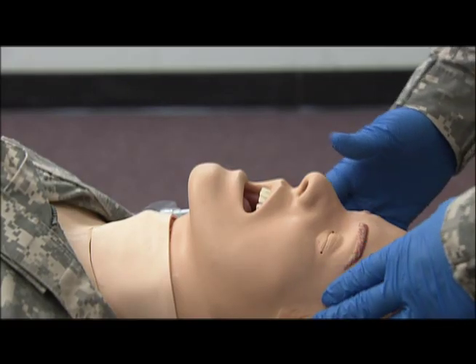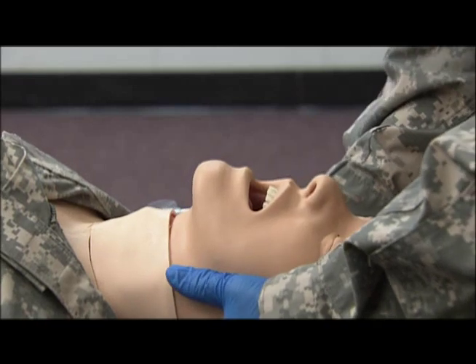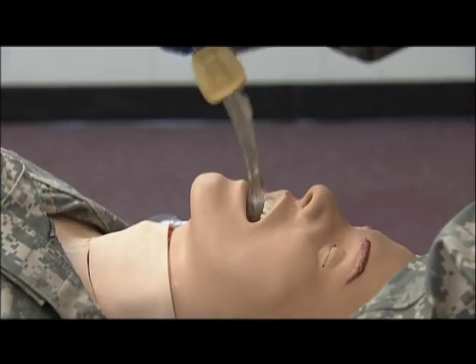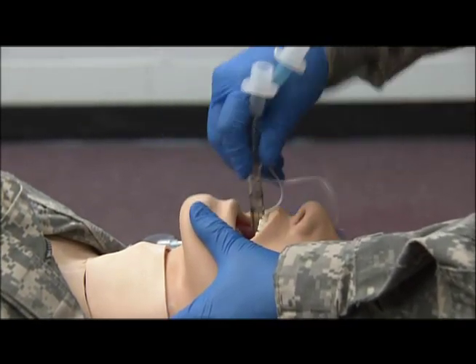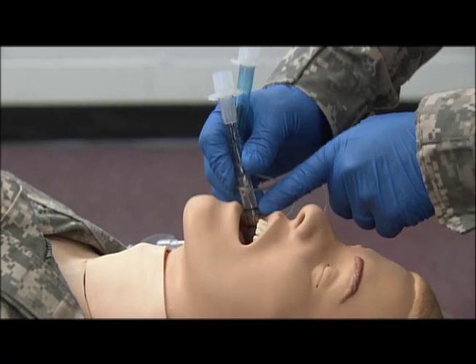My next step is to hyperventilate the casualty for 30 seconds. I'm going to place the head in a neutral inline position. Grasping my combi tube, I'm going to insert into the casualty's throat with firm and gentle pressure until the teeth are lined up with the guidelines on the combi tube.